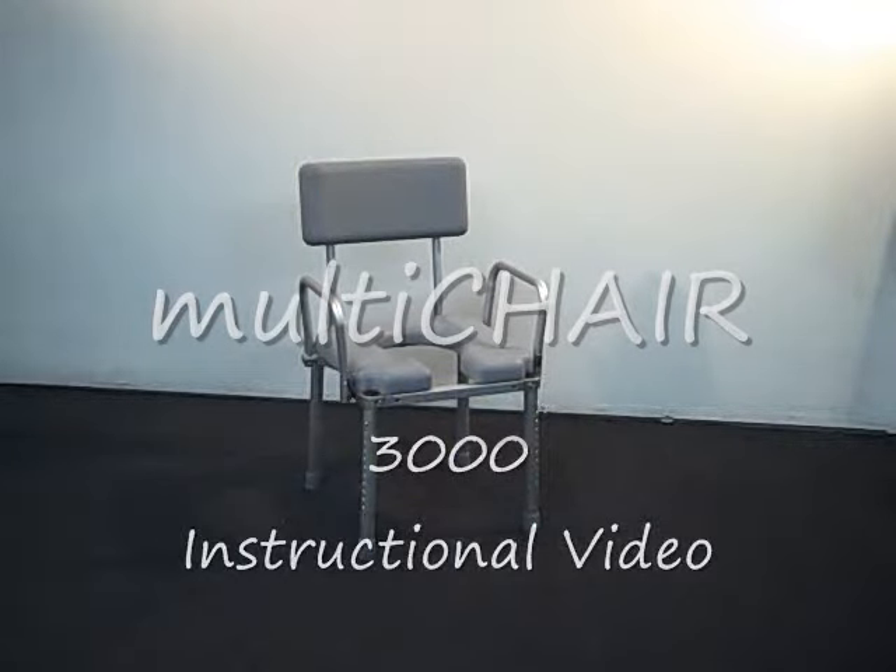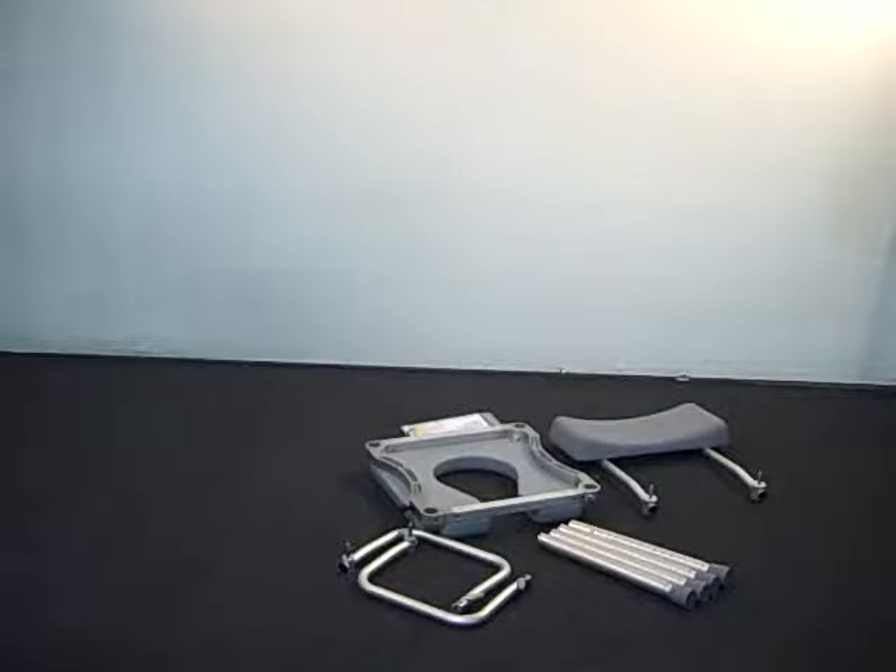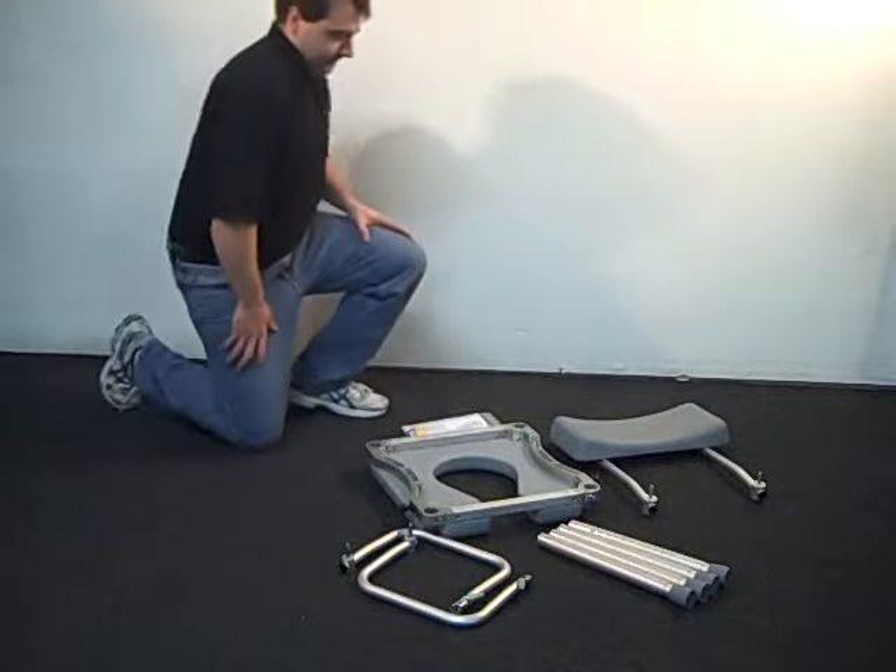The following is an instructional video that demonstrates how to assemble the Multi-Chair 3000. After you receive your chair, unpack all parts from the shipping carton.